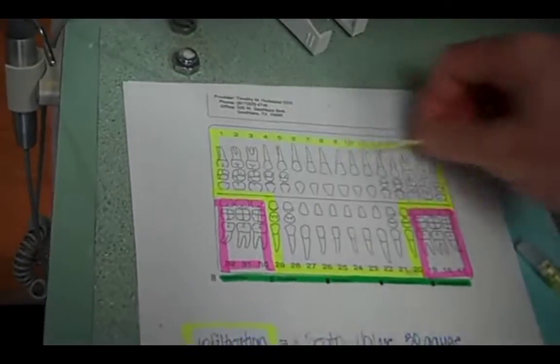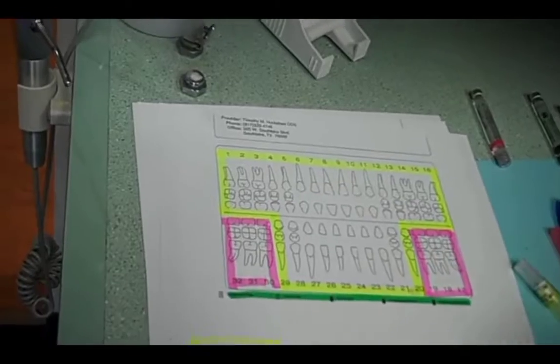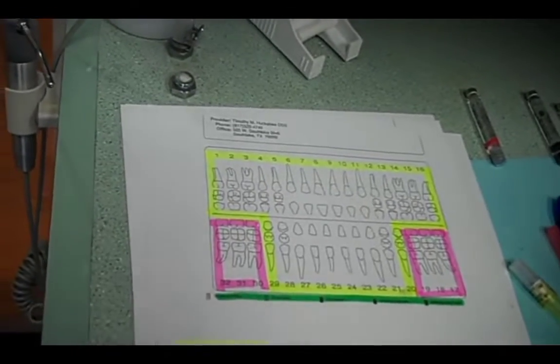Okay, so this is how we utilize the most common injection in the office. All right, now let's talk about the second most common injection in the office.